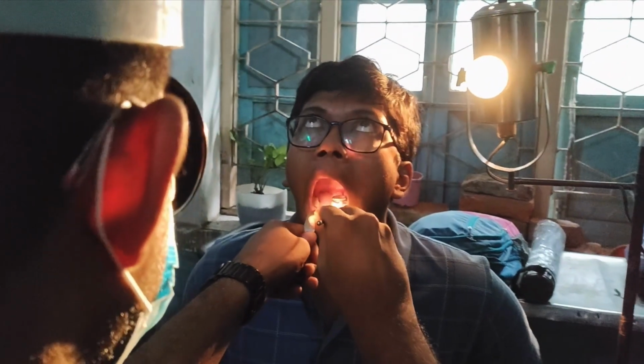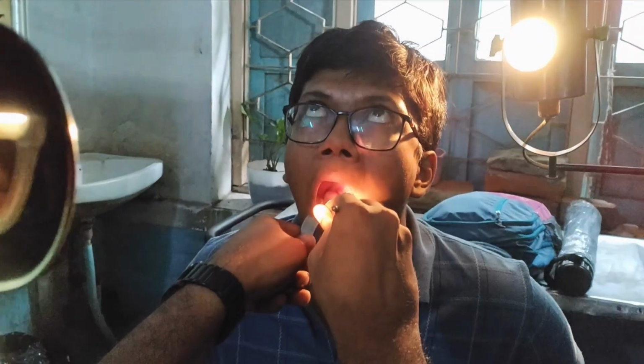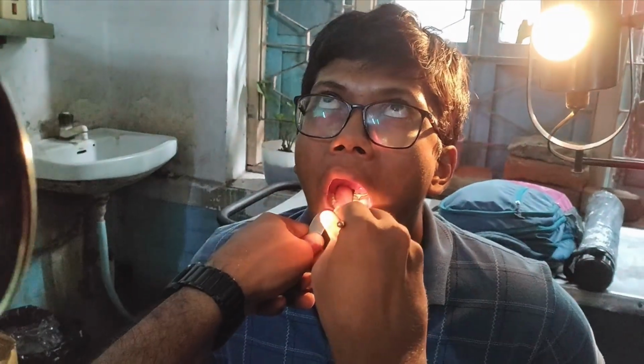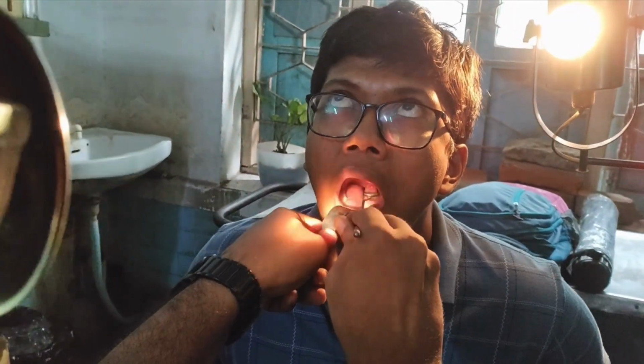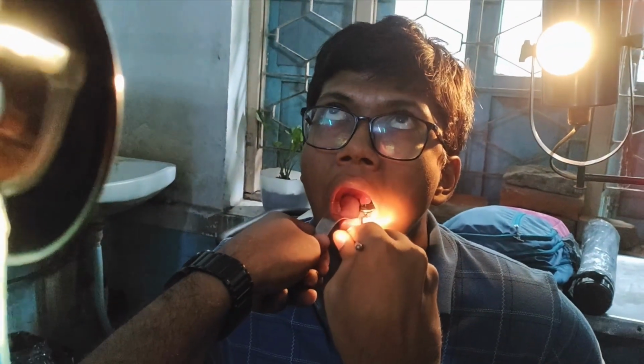Then I'll introduce the PNS mirror like that, in that fashion. Since the patient's uvula is getting in the way, it is a little difficult to perform posterior rhinoscopy. See, the patient lifted his hand because his gag reflex was activated.